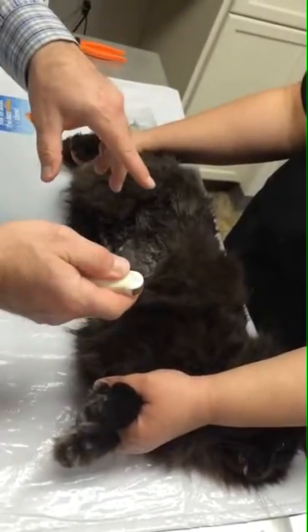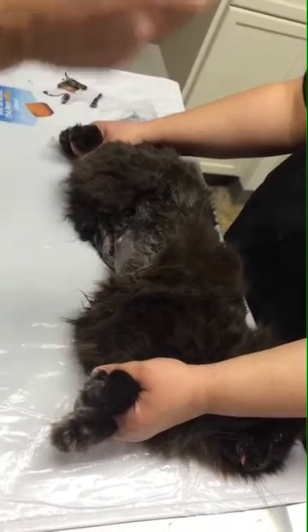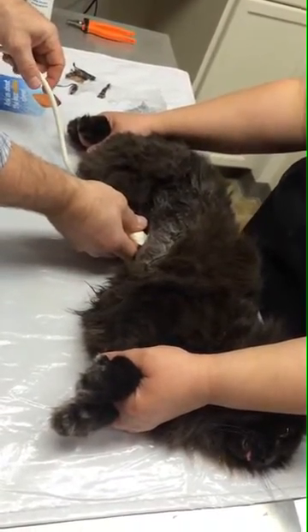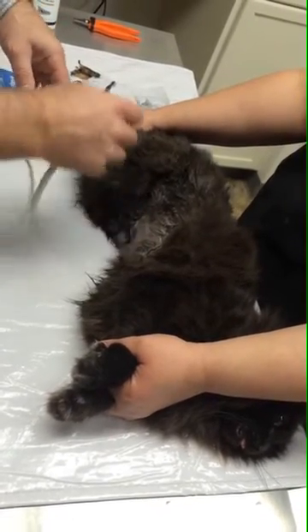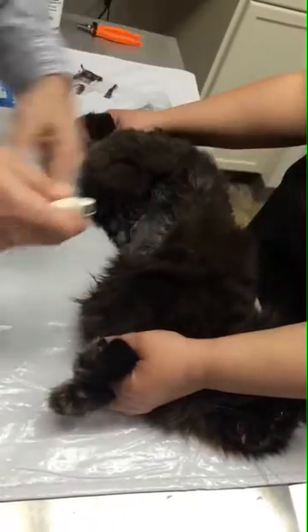On the S-type protocol, usually when we're doing an echo, the head is towards the machine, they're on the right side down, and we usually do a transdiaphragmatic view to get the aortic outflow so we don't have to flip the animal. But when we're having trouble getting that aortic outflow, what we can do is go back to the traditional approach with left side down, head away from the machine.